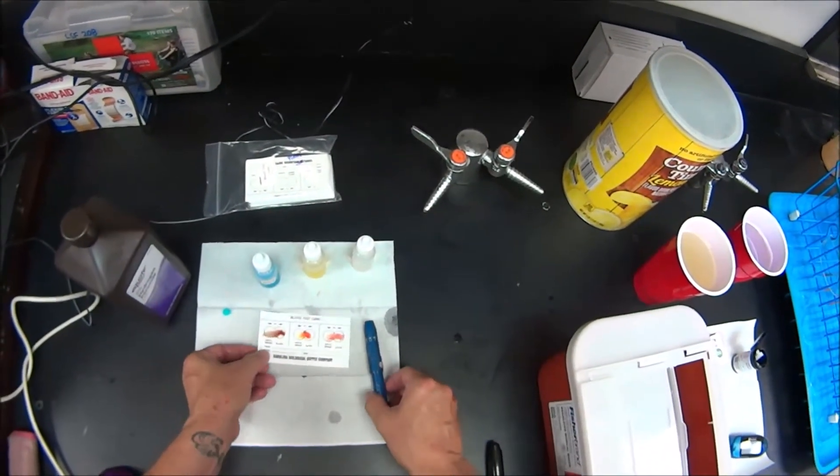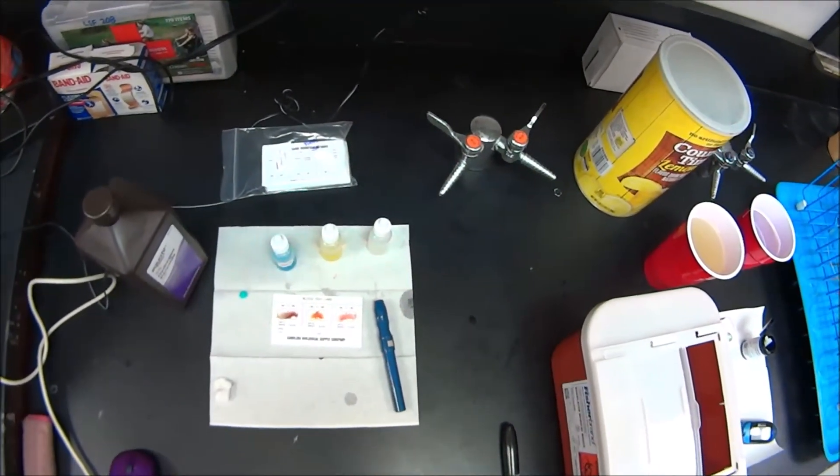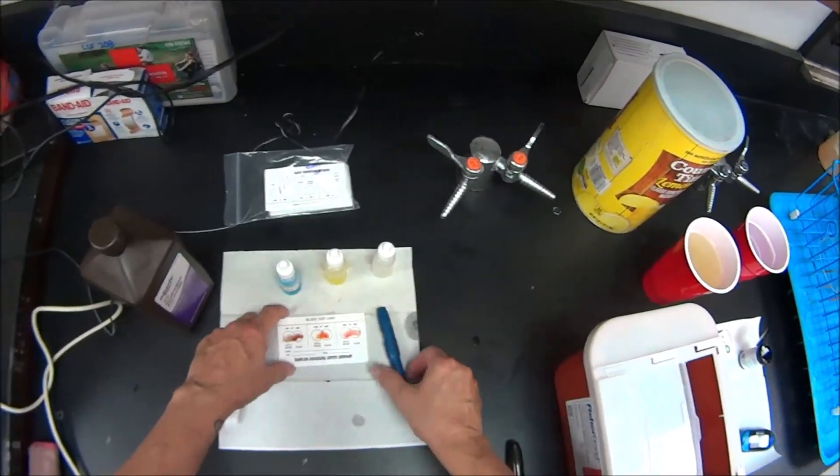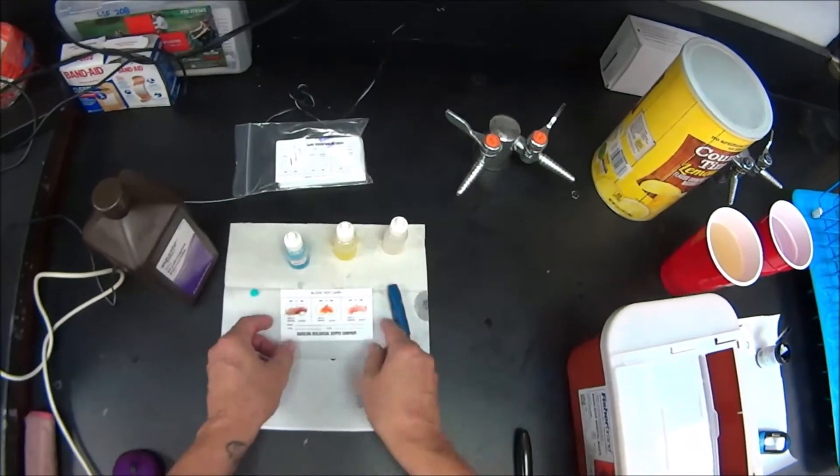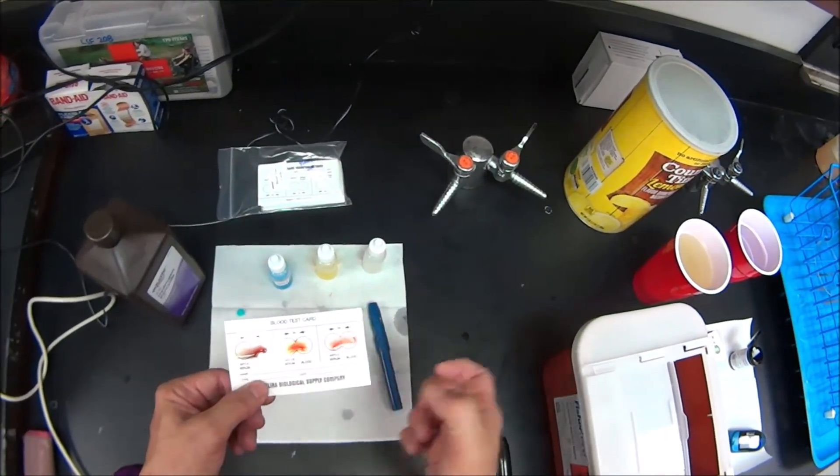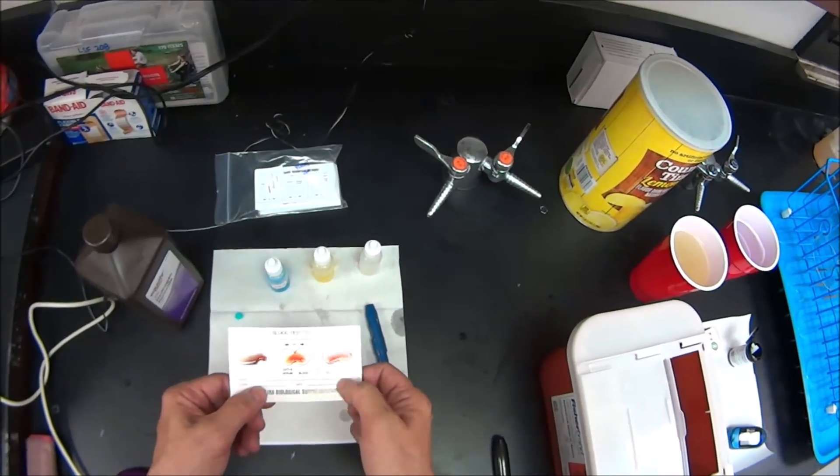Do you know what blood type that makes you if you lack both of those antigens? You're going to have to answer what blood type that is as part of your blood typing questionnaire. So again, no agglutination in A, no agglutination in B, but I have agglutination in the Rh well.